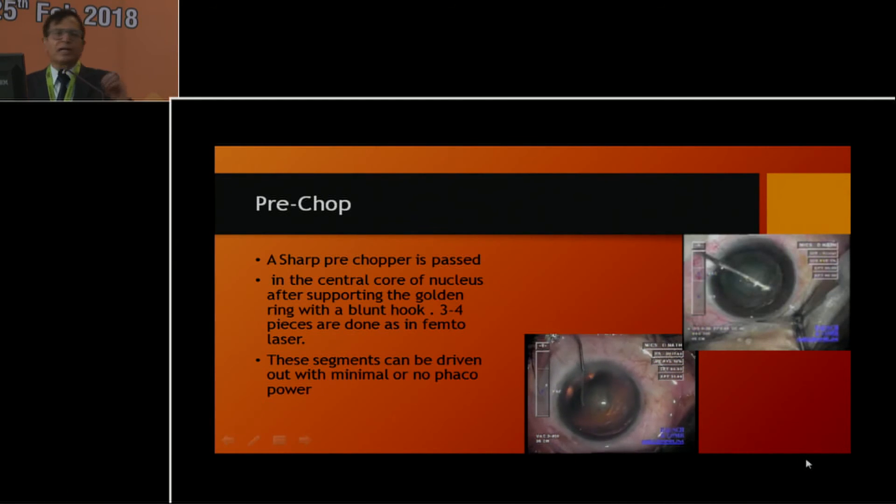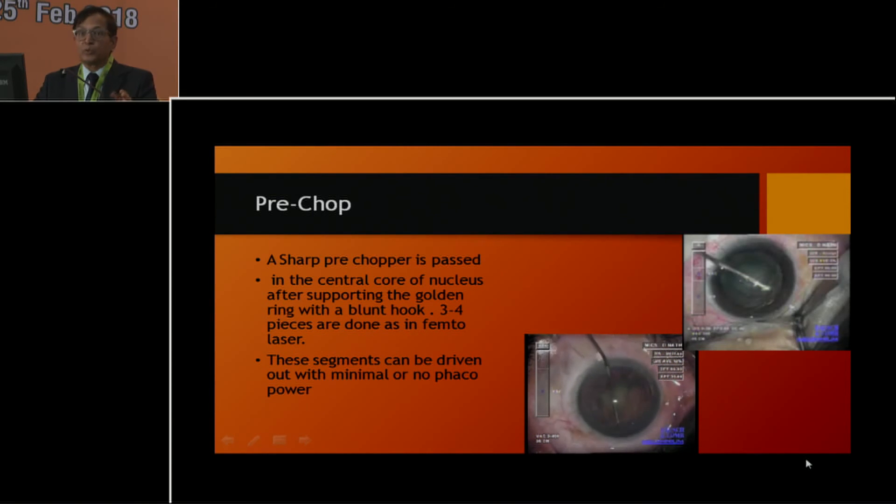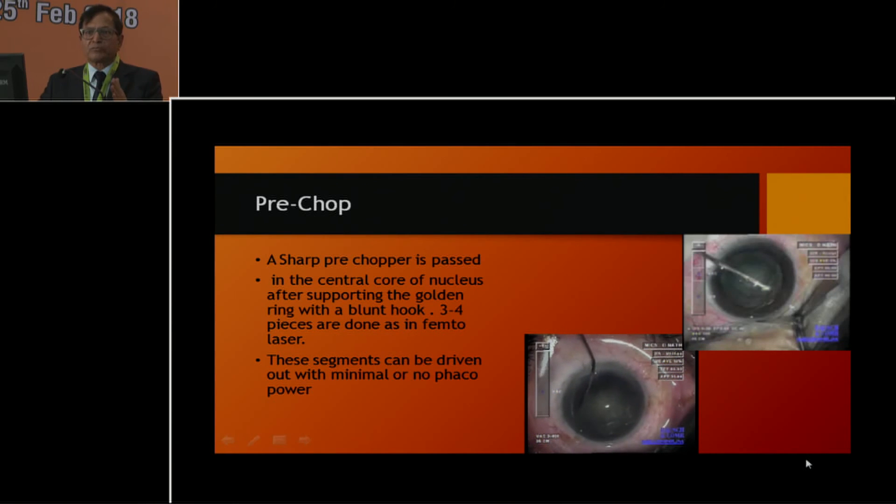Let me go through the pre-chop technique, which was again devised by Nagahara for soft cataract. We use this pre-chopping quite often, but younger surgeons are not able to do it because they don't appreciate the sharpness of the blade. You should know the sharpness of the blade — if it is sharp, it can go in; if it is not sharp, it will not go in.